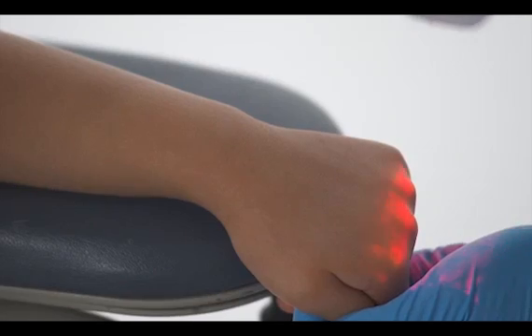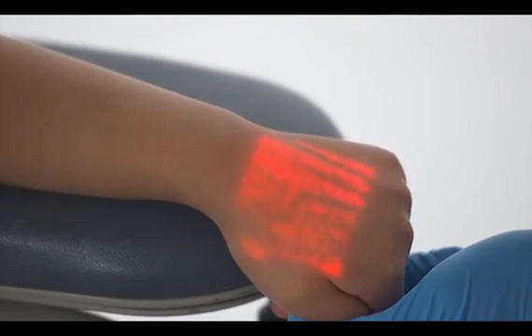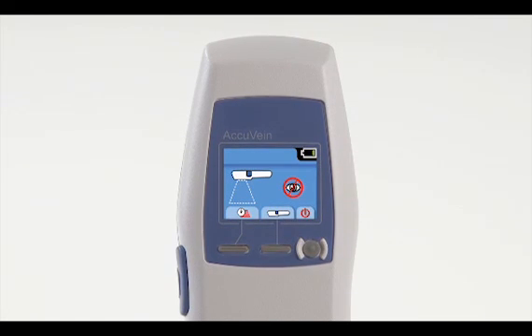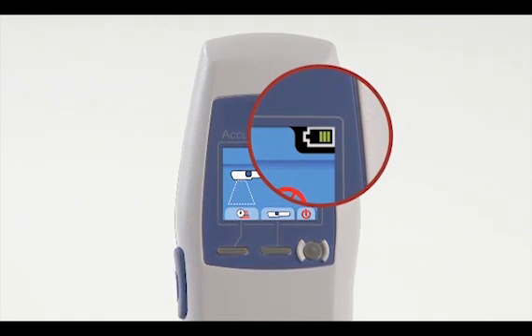Once the device is on, make sure that it is sufficiently charged. The battery power level indicator should display at least one bar in the upper right-hand corner of the screen.